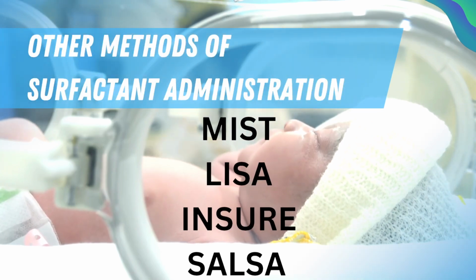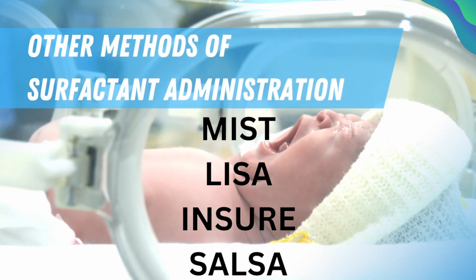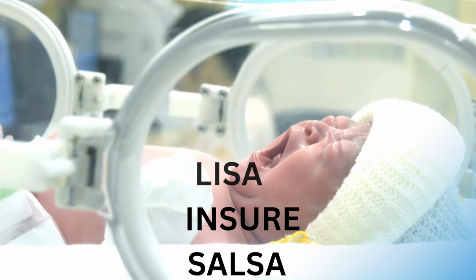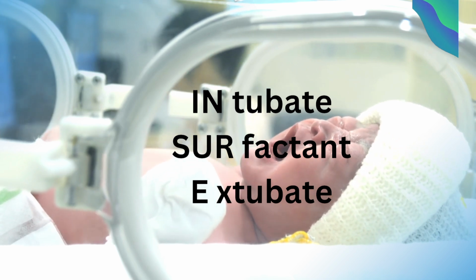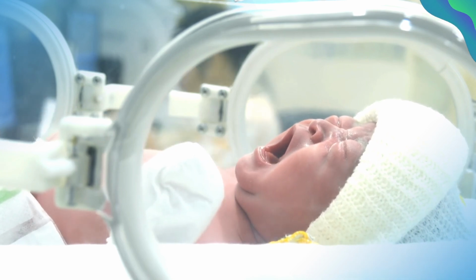You've probably heard a number of different acronyms for surfactant administration, including MIST, LISA and INSURE, and it's hard to keep track of what they all mean. INSURE stands for intubate, surfactant, extubate, and it is essentially the same as a LISA procedure, only an ET tube is used rather than a surfactant catheter.